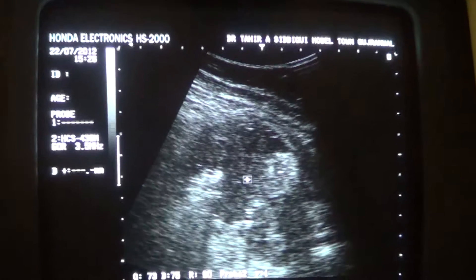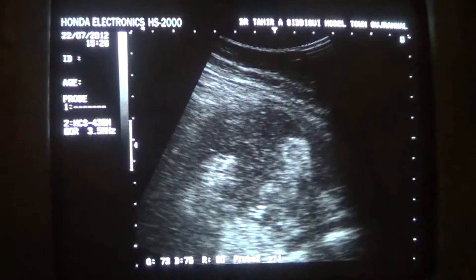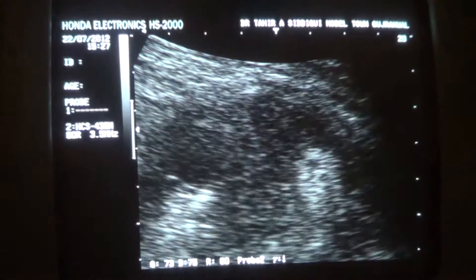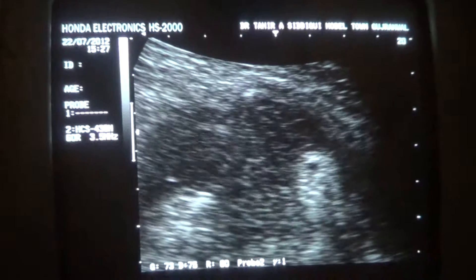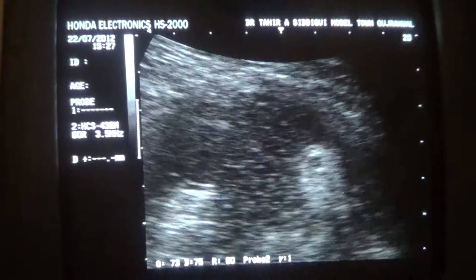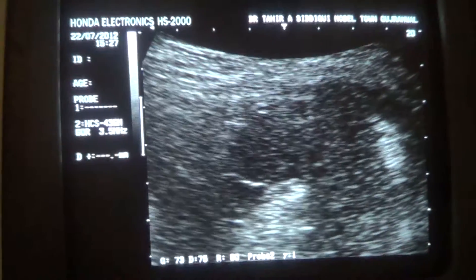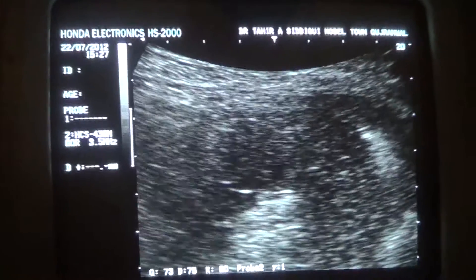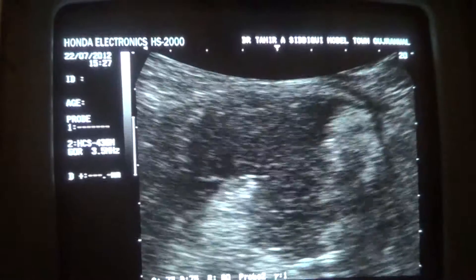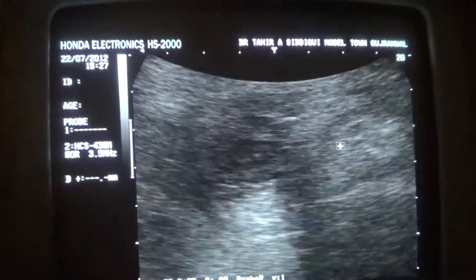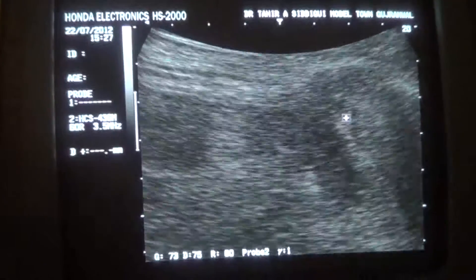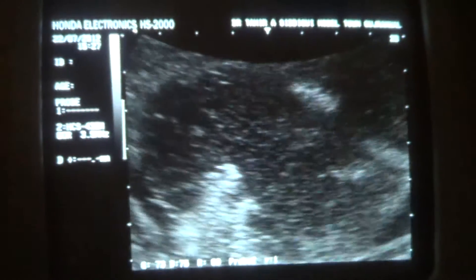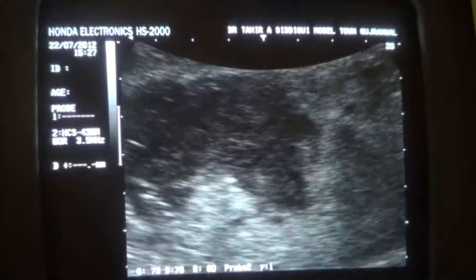Sand-like particles. And if you see in detail — let's magnify — you will see movements in it. I am not moving the probe, but you can see the movement in this debris. All debris — see the movement. And these are the bowel segments within it.